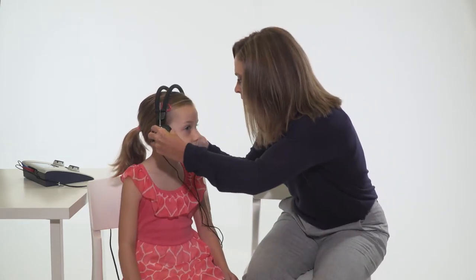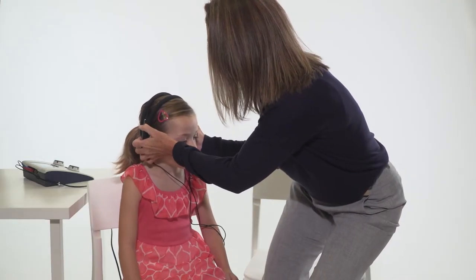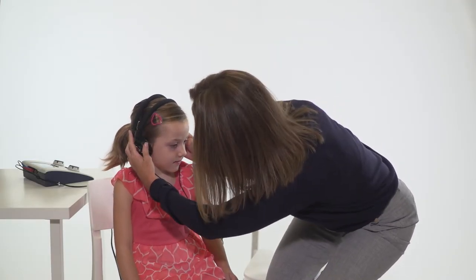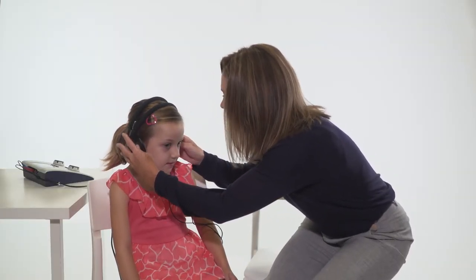Place the headphones directly over the child's ears with the red phone on the right ear and blue on the left. Remove any obstructions that may interfere or be uncomfortable, such as glasses. Adjust the headband so the headphones are centered over the ear canal.